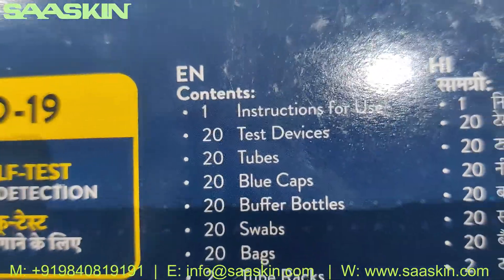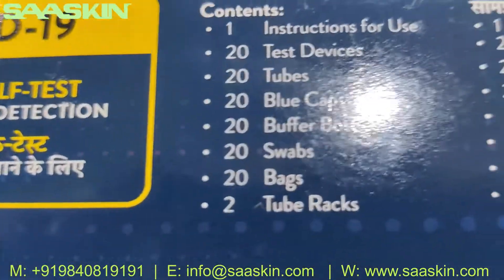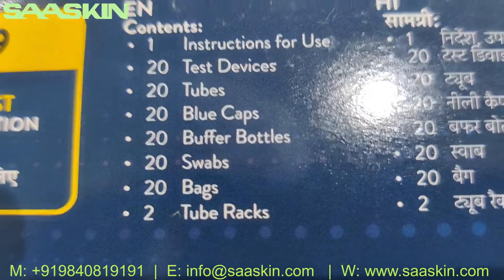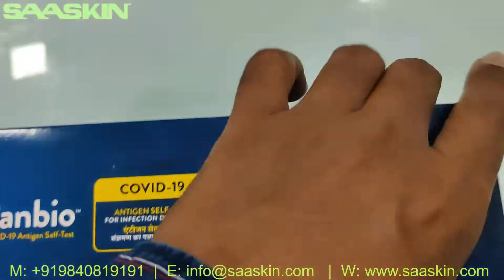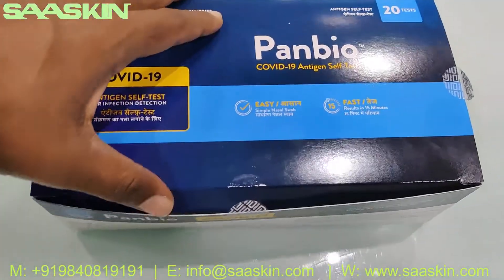Each 20 test kit pack contains an instruction manual, 20 test devices, 20 tubes, 20 blue caps, 20 buffered bottles, swabs, bags, and two tube racks. Let me unbox this for you and show you the contents inside.